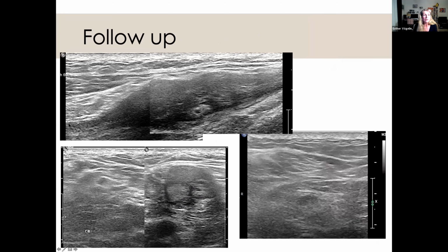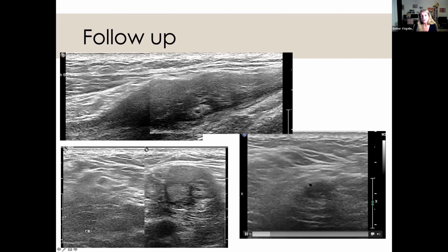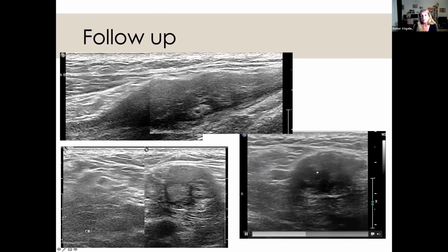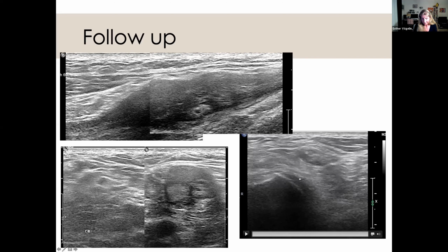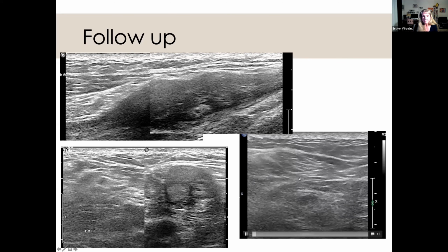And you see now after the debulking, you can see the entry of the peroneal nerve, the rest of the tumor shell, and the exit of the peroneal nerve. You can also look at the healthy side now with the cross-sectional area. This is the peroneal nerve at the same location where you see it in the involved area. And now after debulking, you have a chance to follow the common peroneal nerve at the distal femur over the whole area. This is the femur here.